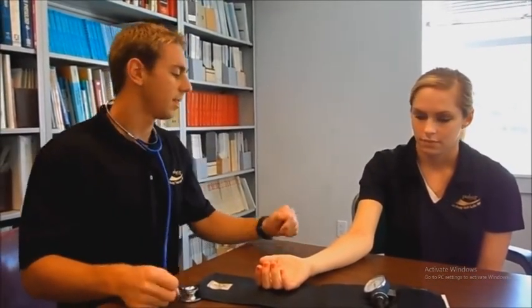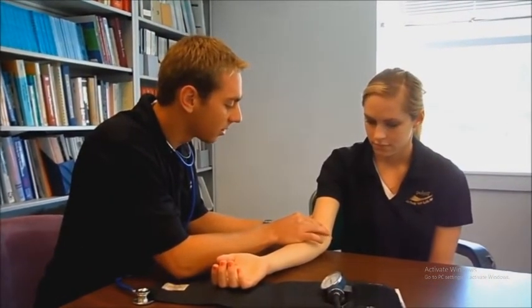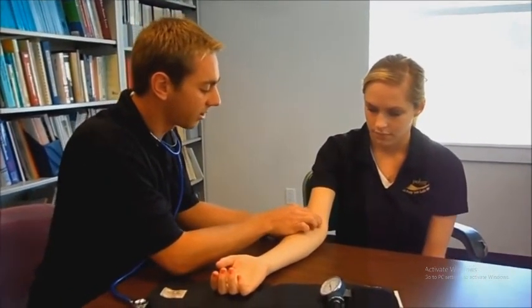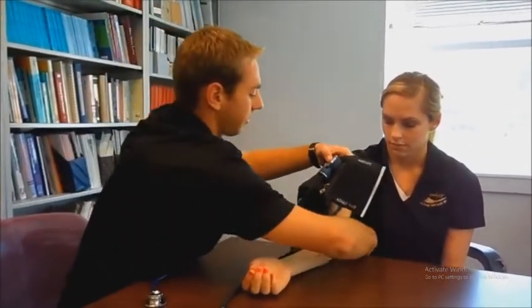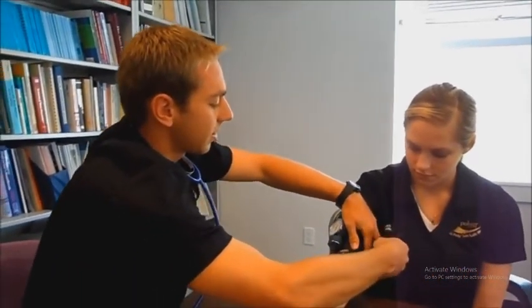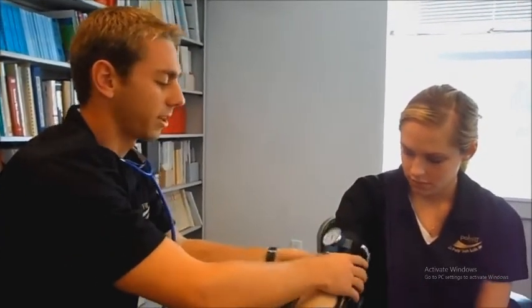Then you have the patient put their right arm up on the table, and we use the right arm just for consistency throughout all the tests. What you're going to do is try to find a pulse on the brachial artery. It's usually towards the inside of their elbow, around here. You take a little mental note of that, and you're going to wrap the cuff around their arm. Keep it snug but not super tight. You just don't want to have it loose and wobbling around.